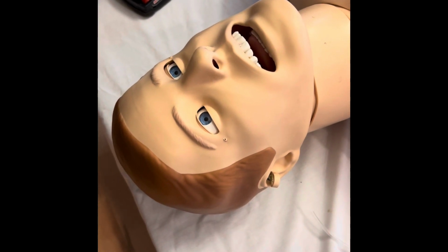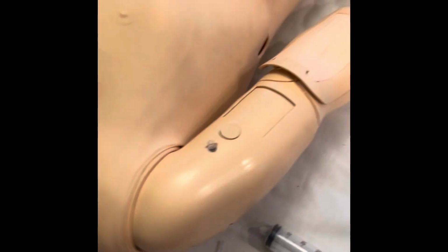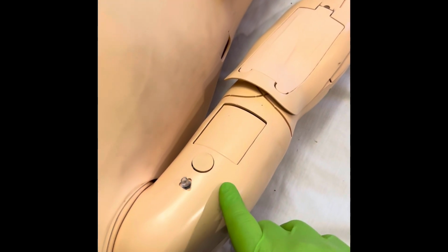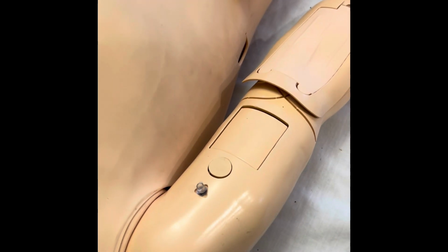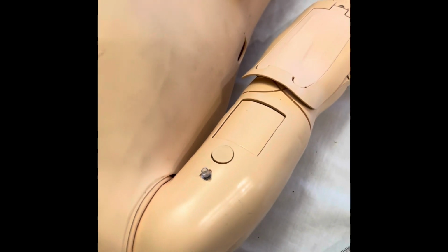Today we're going to be working on the SimMan Essentials bleeding right IV arm. When the IV arm won't flow, the mannequin's powered on, you've got a syringe hooked up here and you're pushing fluid through and priming it with the button here, and no fluid's going through. It's because of one of a couple of reasons. I don't really see a huge benefit on this, so what we're going to do today is just bypass that.